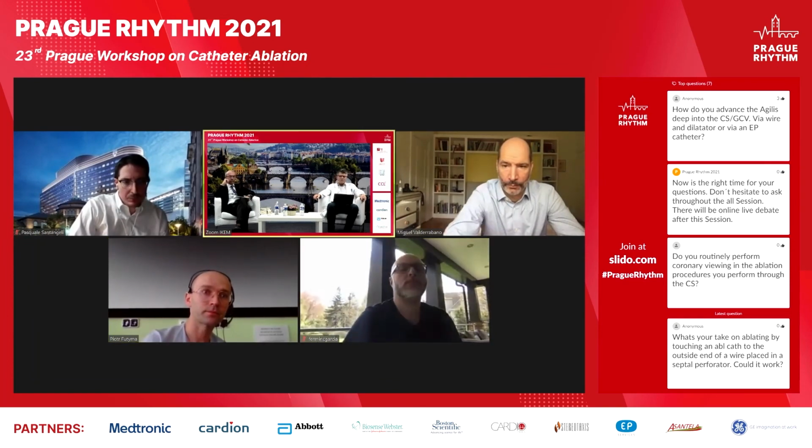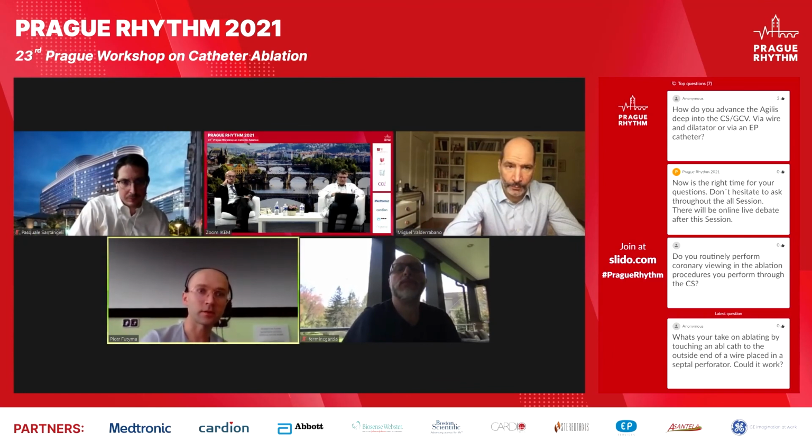I have at least one question. Your topic today is LV outflow tract ablation, or RV-LV. Do you use the bipolar energy or bipolar setting in other regions, like RV-LV or at the atrial level? Yes, absolutely. The LV summit is the most common approach for me.